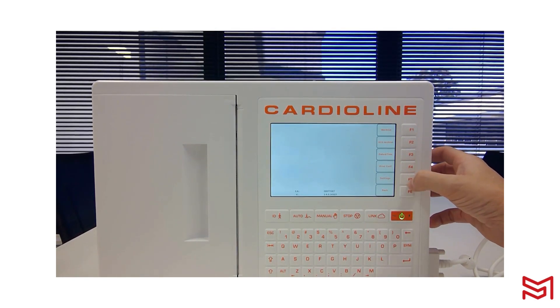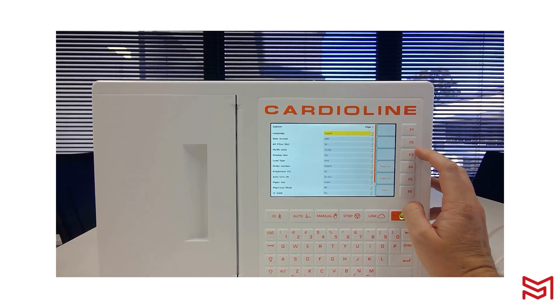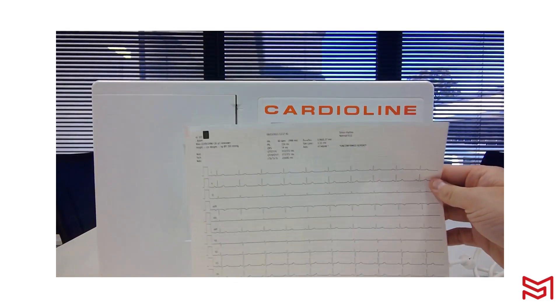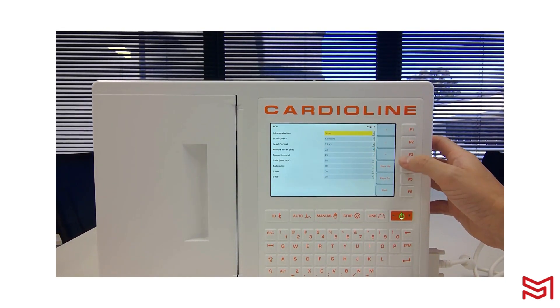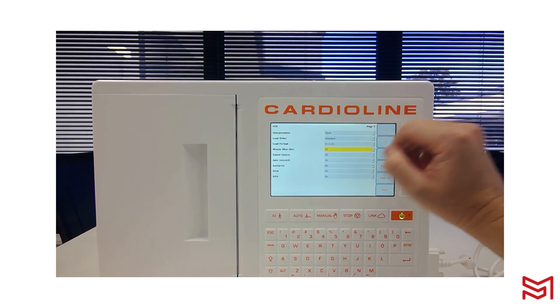In settings, I want to change my print format. Previously it was 12 by 1. Page down — the lead format is what you see on the home screen, and I'm going to change mine to 6 by 1. The muscle filter, when you first get the device, will be set to off — to avoid lead artefact, change that to 25 Hz.